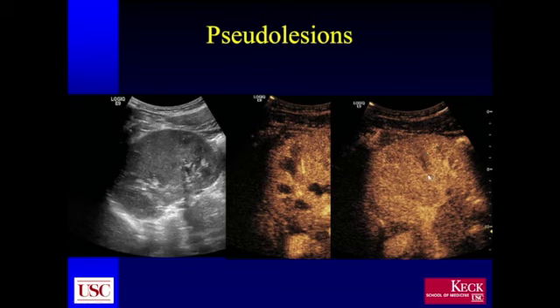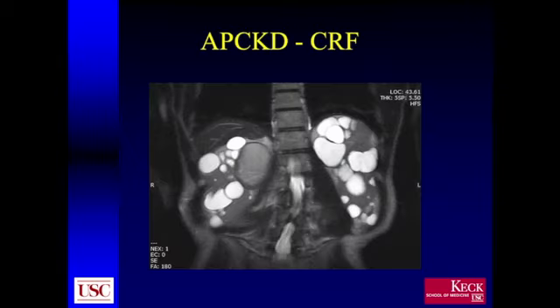So you want to look for similar enhancement, you want to look for similar time of arrival, and you can make the diagnosis cleanly by actually observing the presence of a pyramid in the central portion of these suspected pseudolesions.